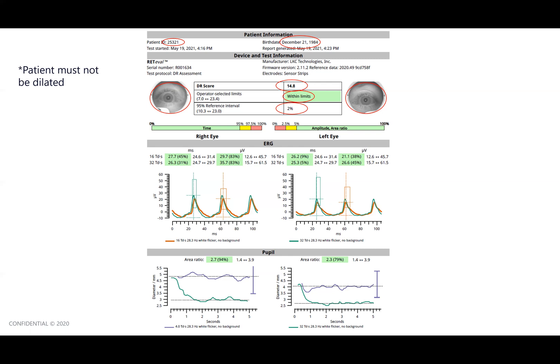If you'd like to look at the specifics, first thing I do is I look at this legend to remind me that if you're thinking about implicit time, high implicit times are bad, are slow, and usually indicate retinal stress or there's something stressing the retina. So anything above the 95th percentile will be flagged as yellow or red. Amplitude is the reverse. Low amplitudes indicate a low strength of response, usually indicate that there's some kind of damage that has already occurred, and anything less than the fifth percentile will be flagged as yellow or red.